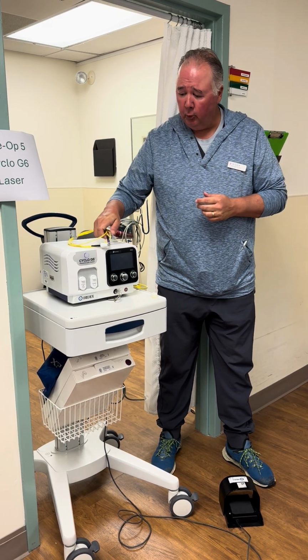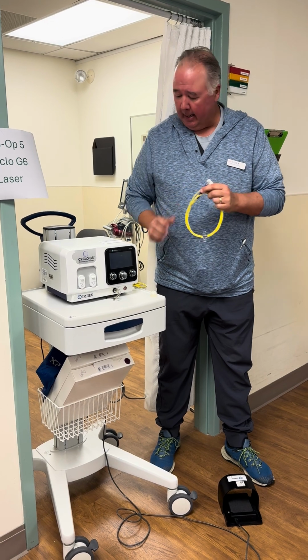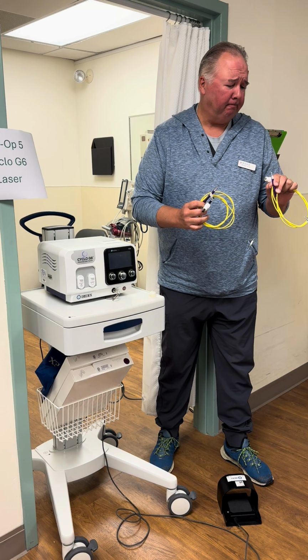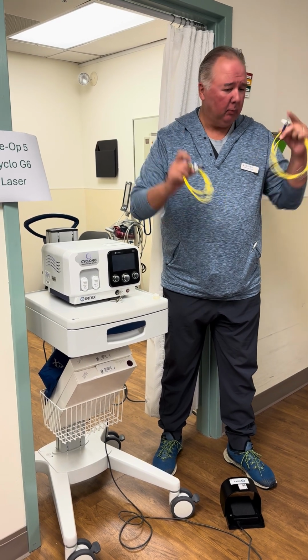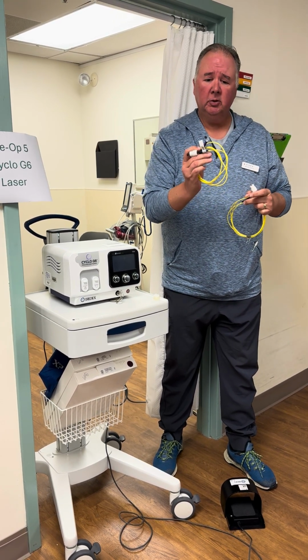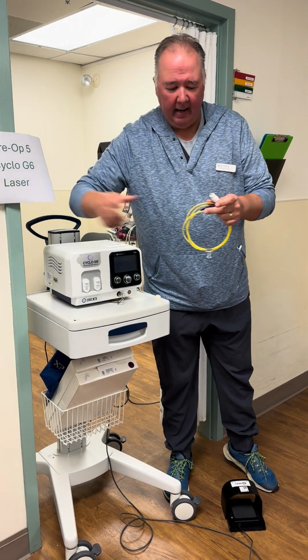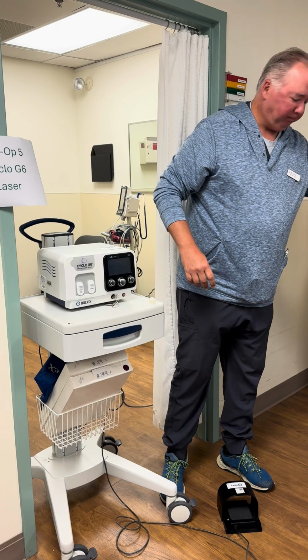That being said, the two probes are different. I don't know if I want to pass these around, but one looks kind of like a rabbit, two little ears, and the other one just kind of looks like a ramp. So I don't know if you want to pass those around. We'll go this way.